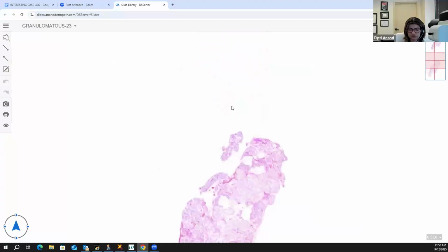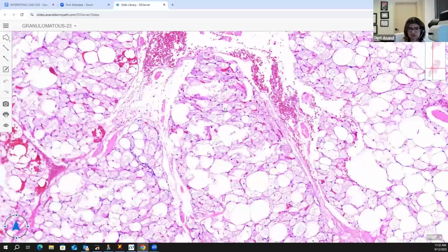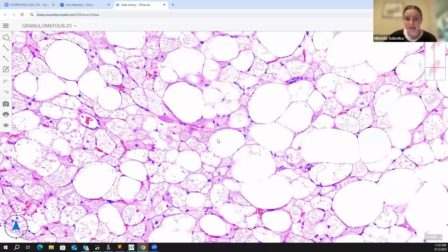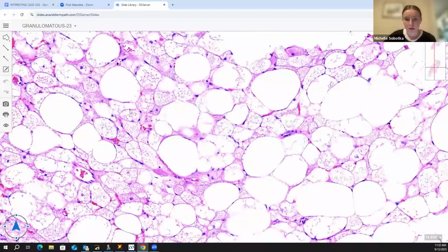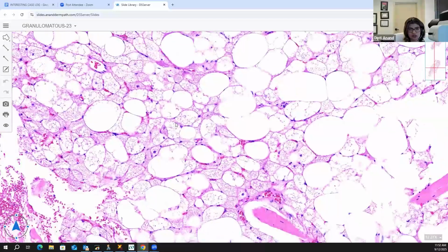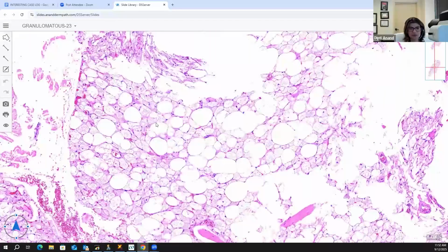Okay, 23. So now you will understand the relevance of this. What is this? I can go for this one. I saw a lot of spiderweb cells and the bright red mulberry inclusions. So this is a hibernoma. Yeah. I think if you've seen it once, you'll always remember it. I think everybody should have been good with it. This is a hibernoma. Good.